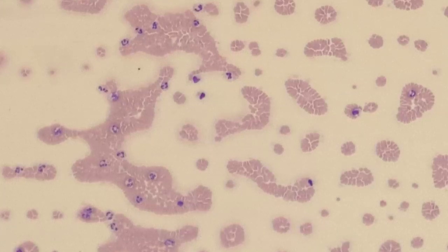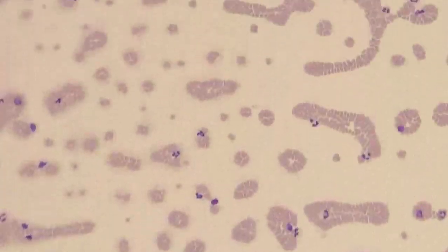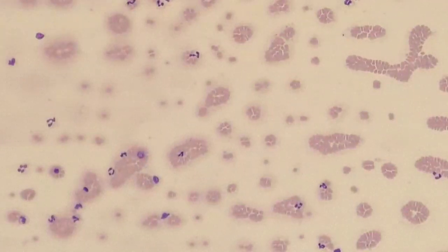One of the things that you want to look for here is the general distribution of white cells, and I would say what we're seeing here is rather normal. If you saw a greater concentration in comparison to what we just looked at, more towards the middle of the slide, you might be concerned. You might want to go back and make a new slide.